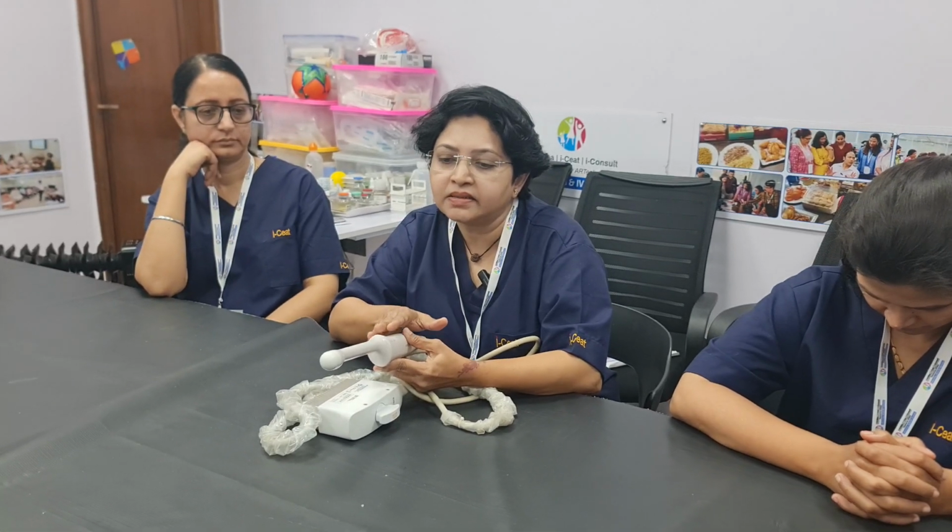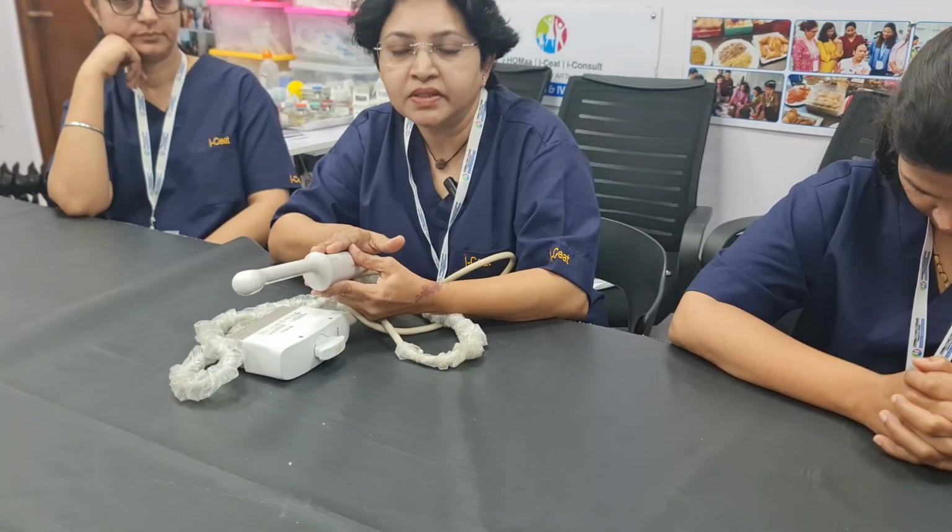Today I am going to speak about TVS scan. This scan is used in IUI for knowing about the follicular study. This is a TVS scan which has a frequency of about 6.5 megahertz, and it is a high frequency probe. It has less penetration with high resolution. So this we use for IUI cycles.